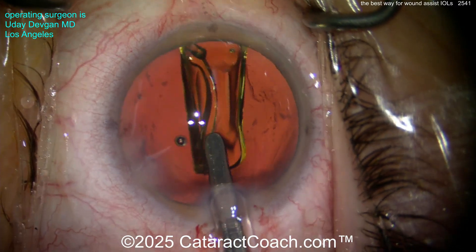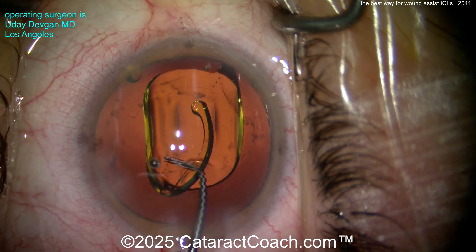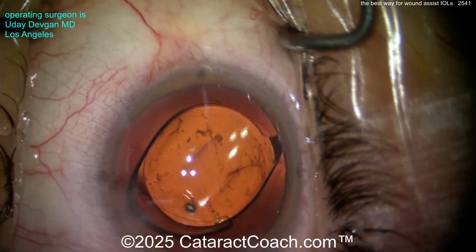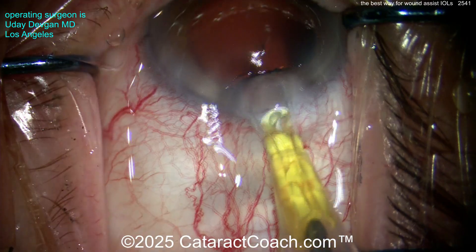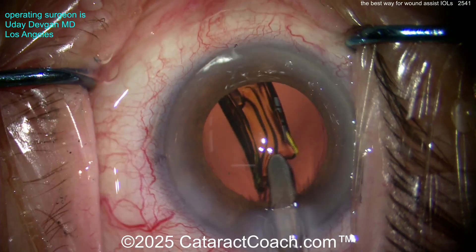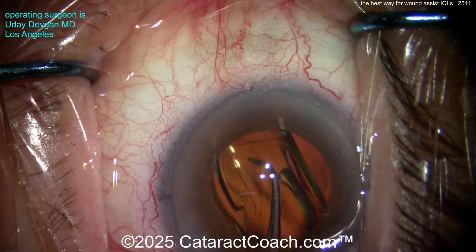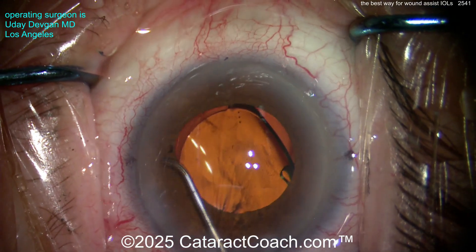Put the leading edge in — now it's a little bit in the nasal canthus, but now get the eye back to primary. With a two-handed injector where the right hand holds the injector tip and the left hand is on the plunger or screw pusher, you need to get the eye back to primary. Put the tip in right there at the wound — the eye is out of primary — but then bring it back into position. As you start to deliver, get a little bit of lens in the eye and then bring it back to primary. Don't insert the whole lens while the eye is shoved in the nasal canthus — you'll have no view.